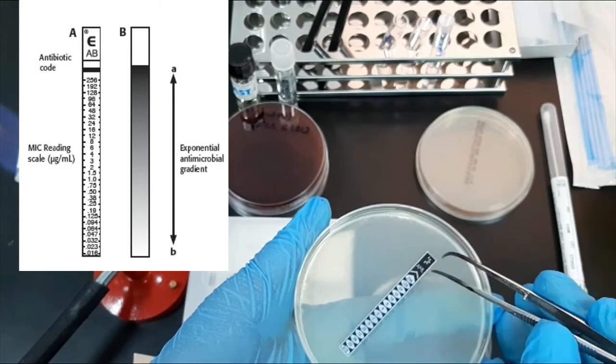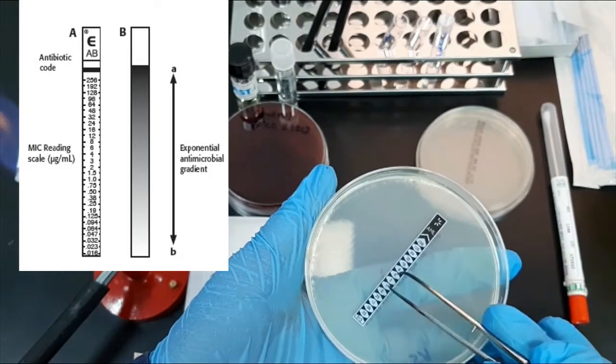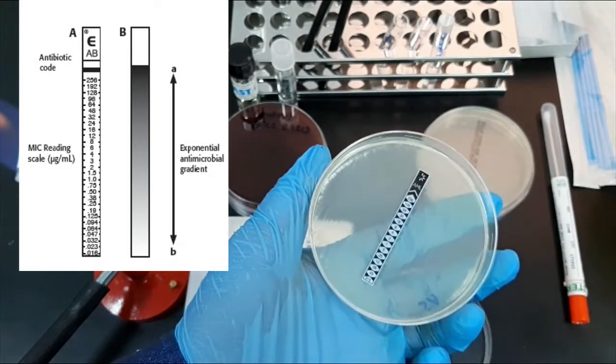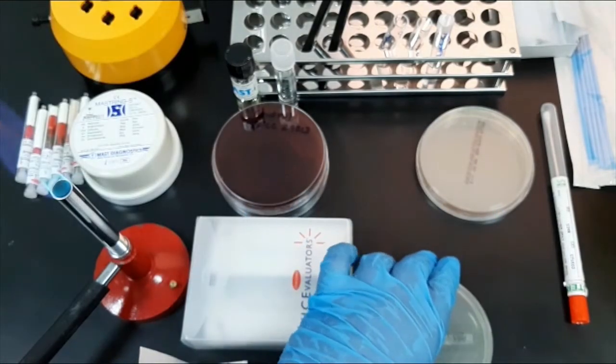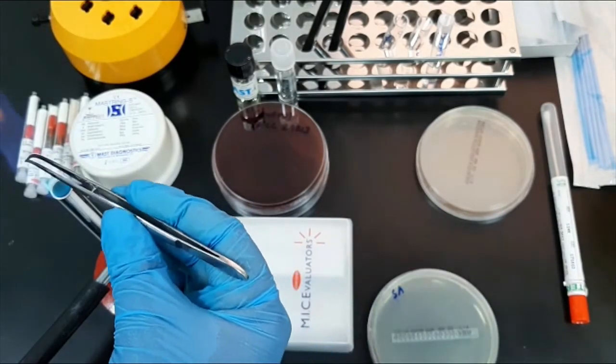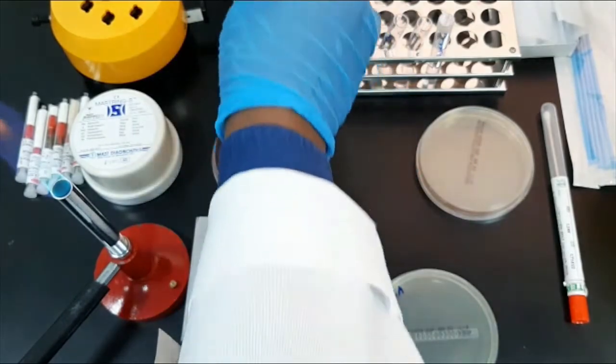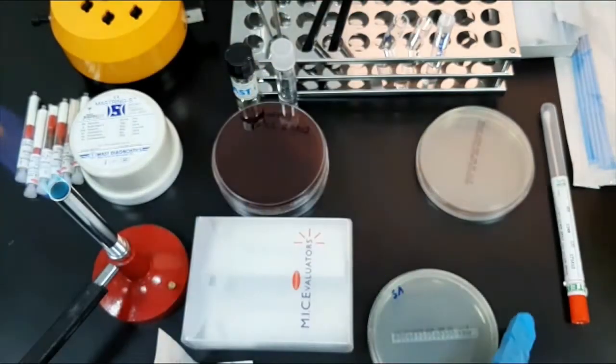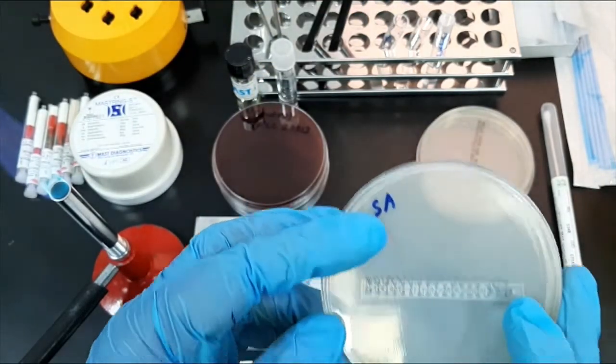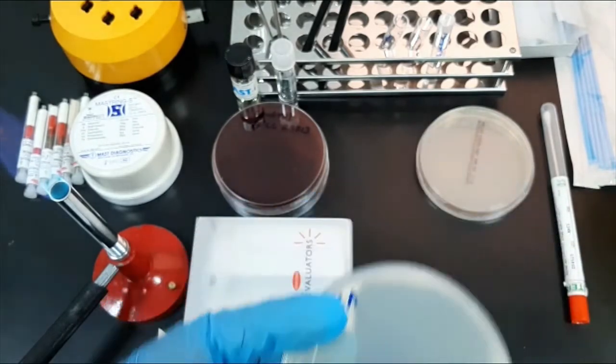When the strip is applied onto an inoculated agar plate, there is an immediate release of antibiotic to the agar surface. The strip should be lightly pressed down to ensure contact with the agar. Then incubate the plate at 37 degrees Celsius overnight in an inverted position.